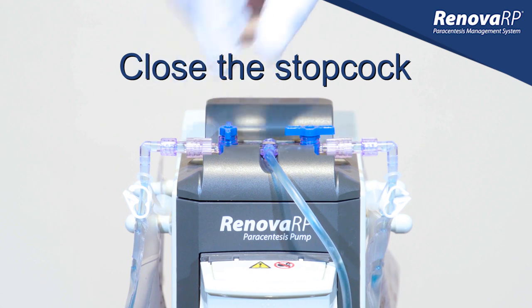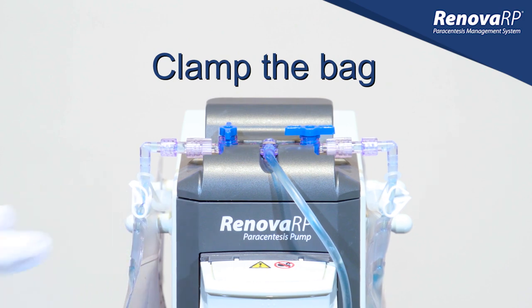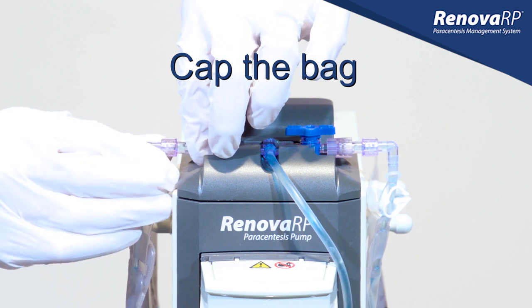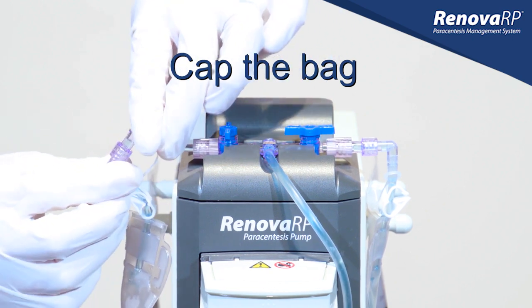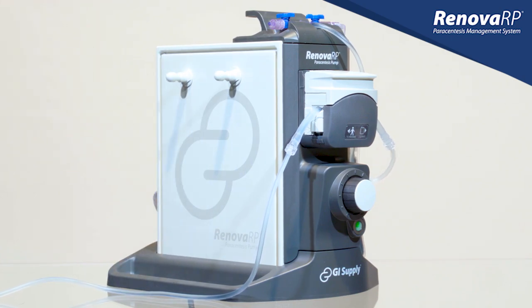Close the stopcock first to cease fluid flow to the bag. Next, clamp the bag shut using the white pinch clamp. Loosen the spinlock connector and remove the bag from the T-connector. Once the bag is removed, cap it and follow your facility's procedural protocol for handling ascitic fluid.